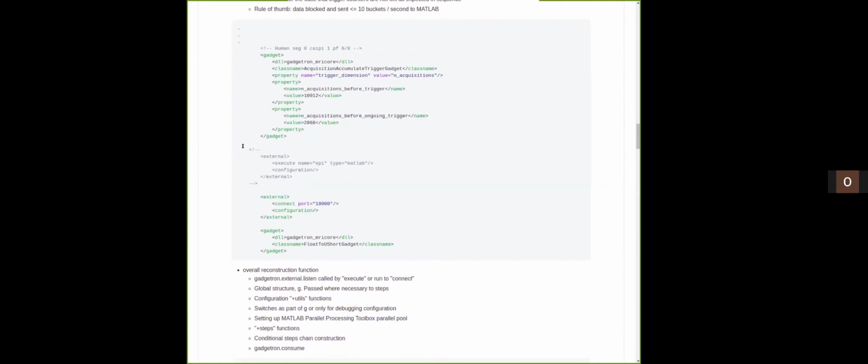And then, as you've just seen, we can directly execute within the container, and MATLAB is available within the container through exposing the MATLAB source tree. Or for debugging, we use the famous 18,000 connect port, and then that can connect through onto the host PC, and we can use MATLAB just as normal on a host.